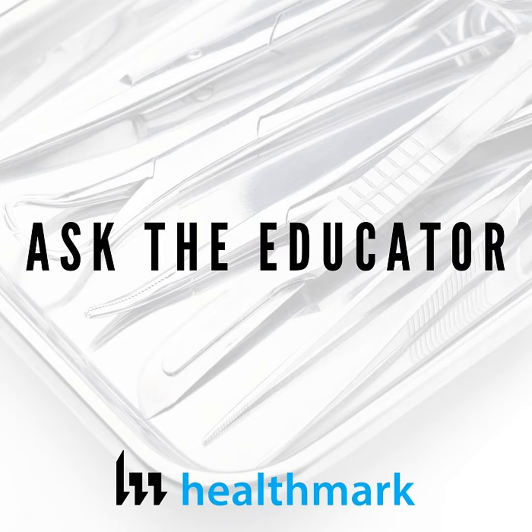The autoclave is very simple. If you can operate your microwave, you pretty much can operate it. It's a push button. But the instrumentation is so complex. You've got IFUs for Da Vinci and flexible scopes that are 50 pages long, 100 pages long, just for one item, right? And then we've got thousands, and then we bring in all the loaners, and the loaners come in from the vendors with no count sheets, very little information.